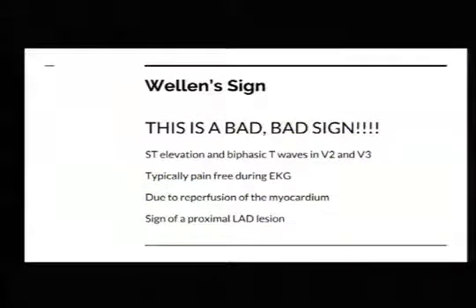This is why the pre-hospital EKGs mean something, because if you guys show me that, and by the time they get to me 25 minutes later and I don't see that elevation and those biphasic T waves, I might check a couple labs and send him home. But if I saw that pre-hospital EKG, I'd be calling cardiology. And they'd laugh at me and rule him out and then stent him later.